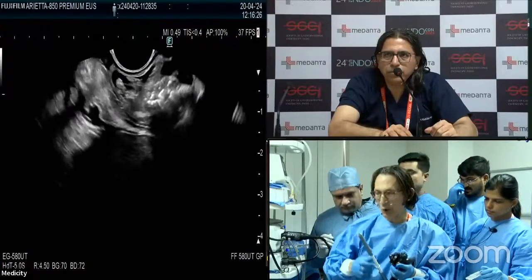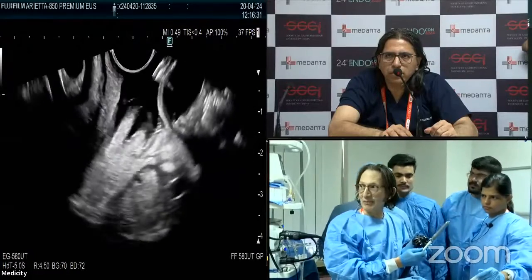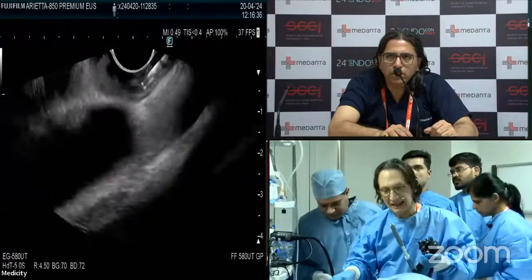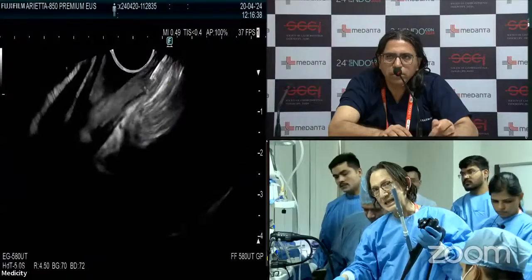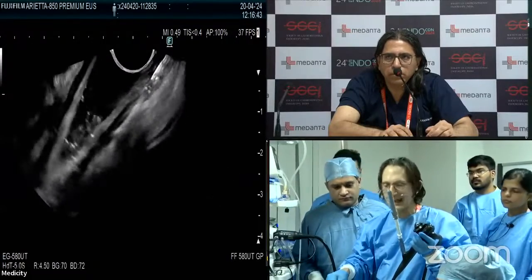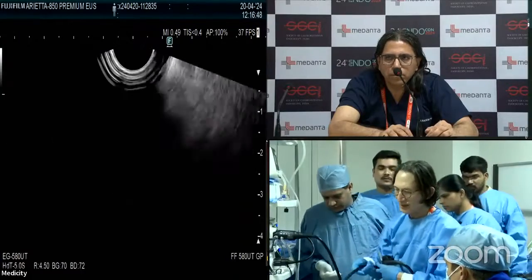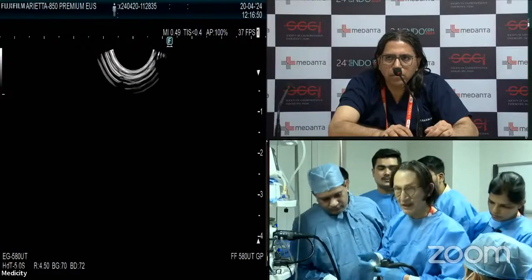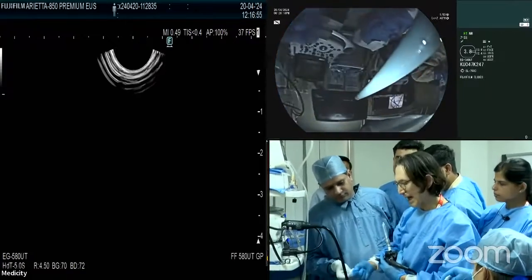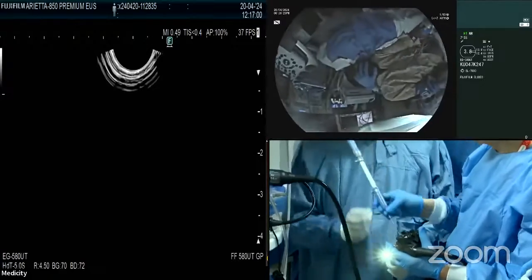I'm going to advance the sheath out in front of me — you'll see it right there on EUS. I'm going to pull the scope out completely. I'm not going to pull the needle out of the working channel because there's a small risk of glue on the tip, even though there's a balloon on the tip of the transducer. You can see the tip here — there's no glue, it looks fine. The assistant wipes that off, and then we remove the needle. Procedure complete.